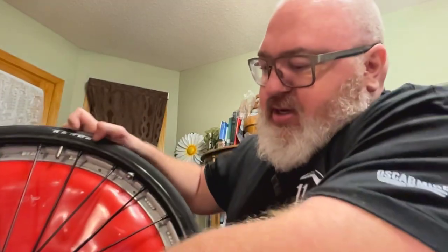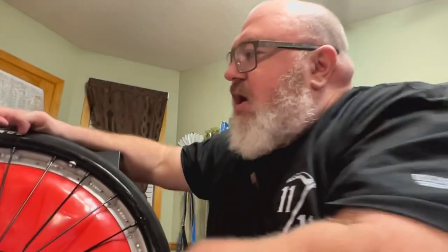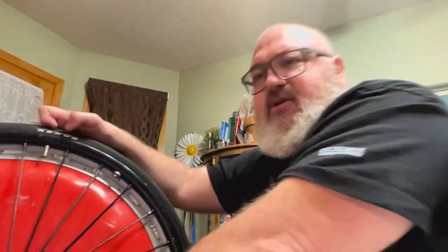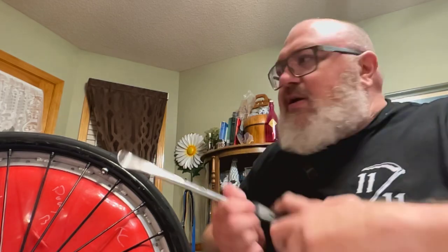So let me explain what I'm doing. I already killed the valve stem. So this is the valve stem. With my wheels, I don't know if you can see it, but they're marked with 120 with the arrow. And then who I am, Doug, KC, blah, blah. So what I'm going to do first, I'm going to find the valve stem, go on the opposite side, boom. And then we're going to stab it with one of these.